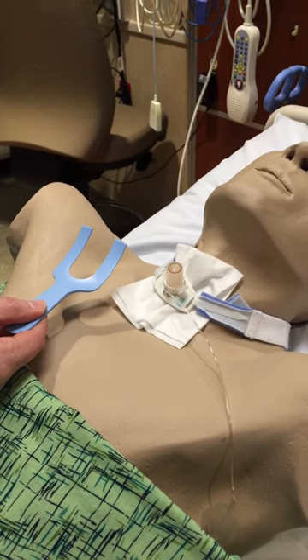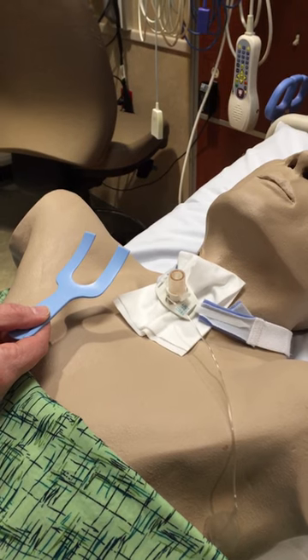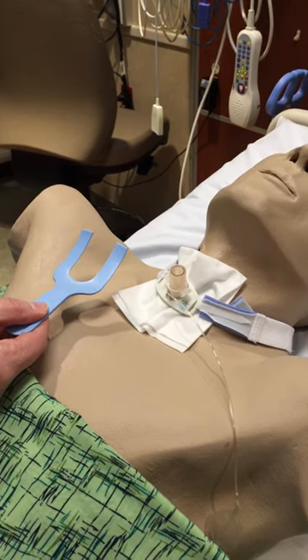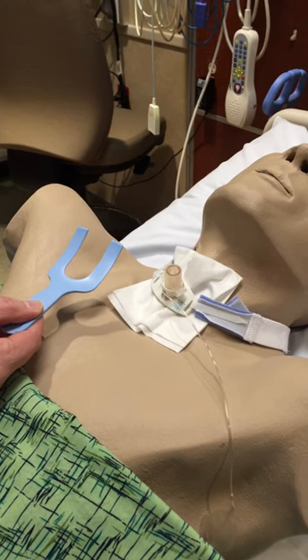Today we're going to demonstrate the use of the tracheostomy dressing applicator, also called the TDA. You'll see we have a mannequin here with a tracheostomy and a dressing in place.